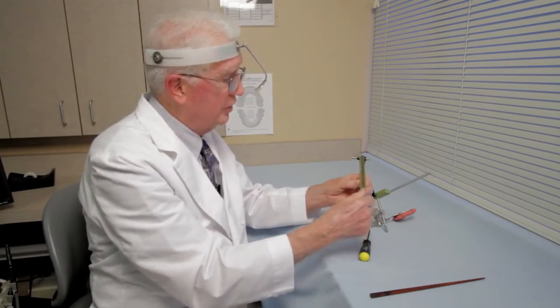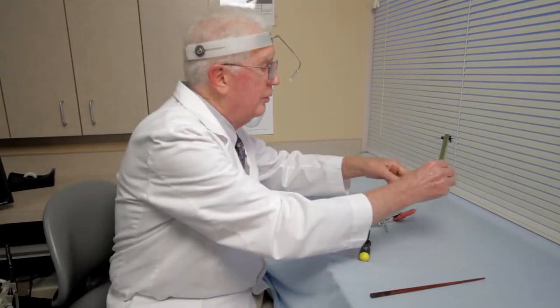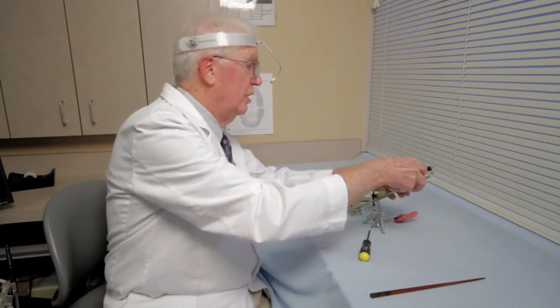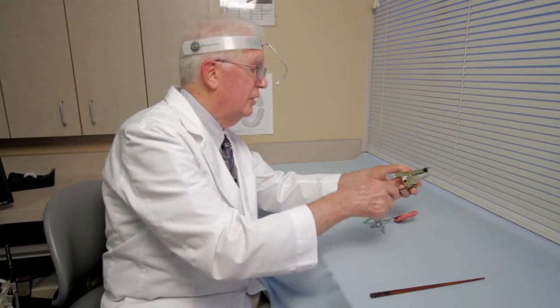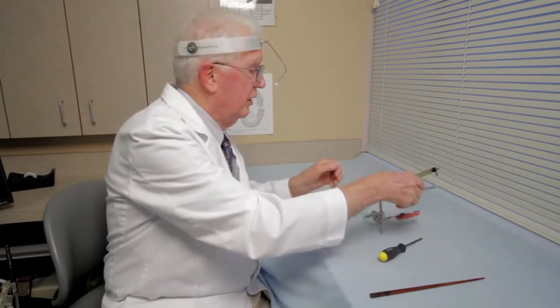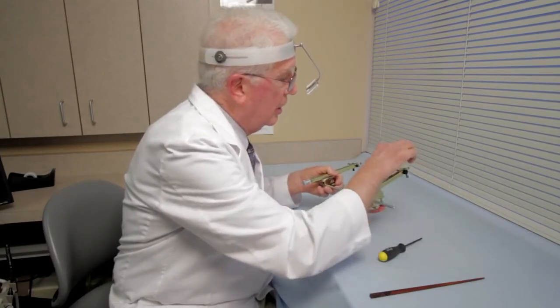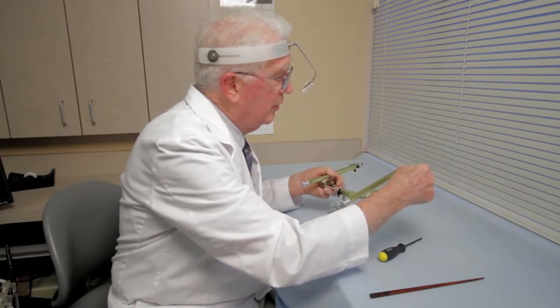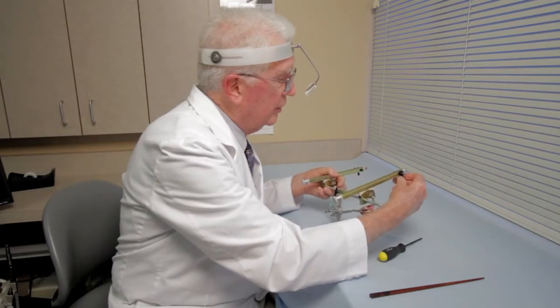Once the gross adjustment is made, and I've estimated about how far it is to the hinge axis point, put it on also. Move it in until it touches the patient's cheek with the dull side of the stylus pen. Lock the side arm in place. Now reverse the stylus pen. Lock it for the moment.